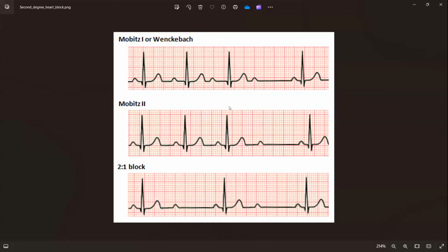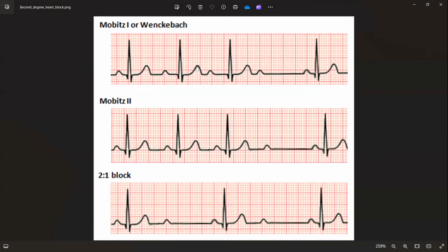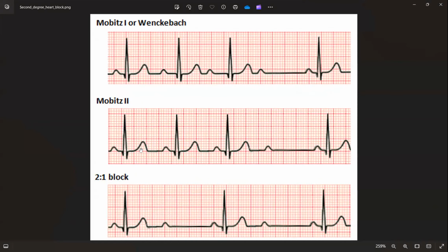this one, can you see the screen? So you see here the Mobitz type 1. Mobitz type 2, which I mentioned first, the PR interval is normal, but sometimes you have only one QRS missing. So that's your Mobitz type 2. What is in Mobitz type 1?